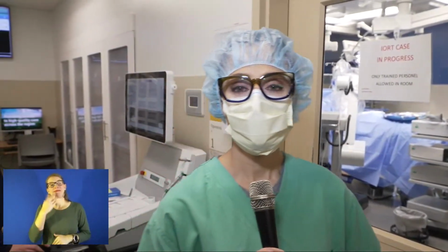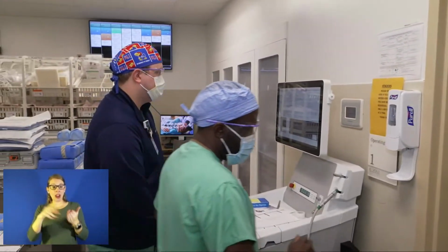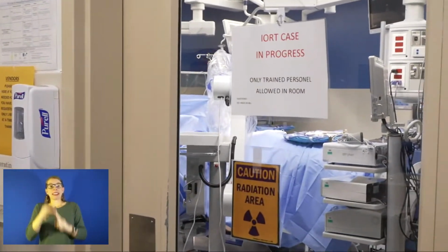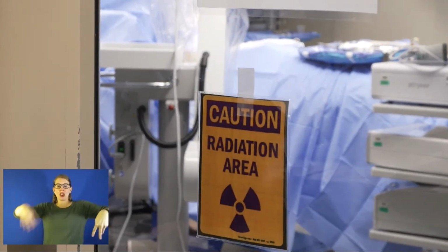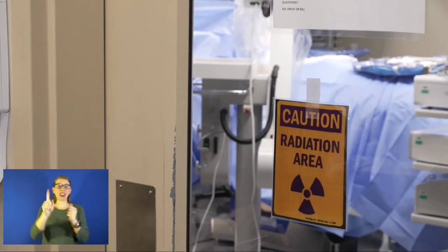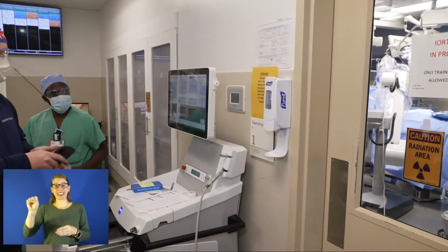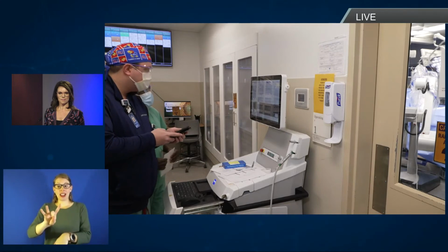This is such a remarkable event. So let's take a look at how this next part works. You see Dr. Neba and Dr. Steckline at their machine, making sure everything is ready to go. Everyone has left the room except for an anesthesiologist who is behind a lead curtain, behind a lot of lead, so that they're not exposed to the radiation. And I'm just going to watch with the rest of you guys who are watching at how this works. But this has really gone beautifully by all accounts today. And it's almost over, Jess, as I toss it back to you in the studio. They're going to start this treatment at 8:28 is the time that Dr. Steckline just gave.